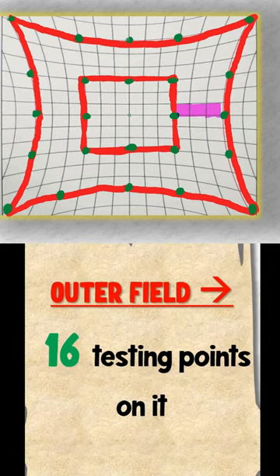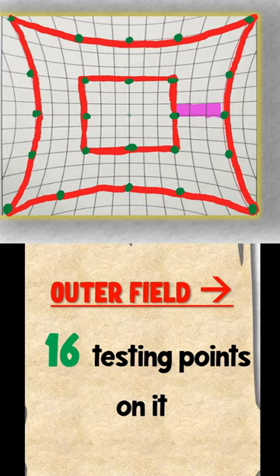This outer field actually has about 16 points located on it for the test.